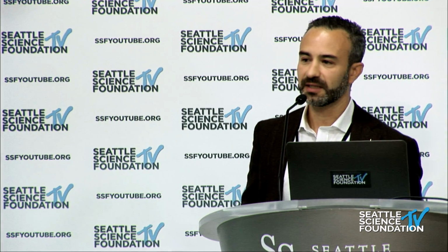Yeah, great question. And I think that's been an evolution for me. Initially, when I started using the hyperlordotic cages, I was cutting my own allograft, and the good thing is you can dial that in, but again, it does add OR time and is rather cumbersome. But the important thing I've come to is that you need a minimum posterior height, and somewhere between 6 to 8 millimeters is kind of the sweet spot.